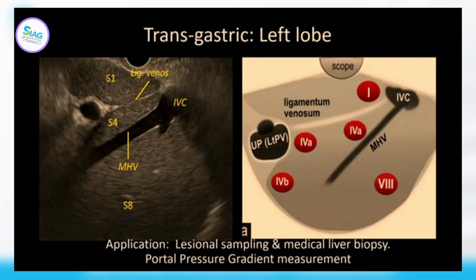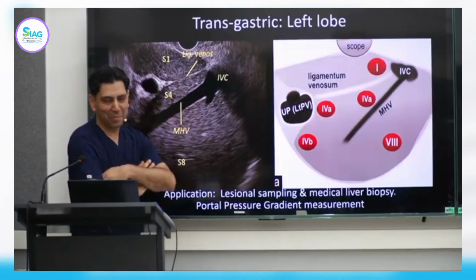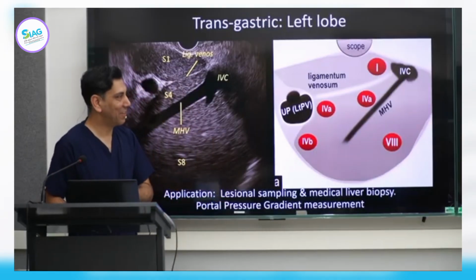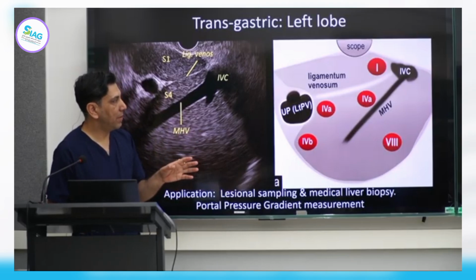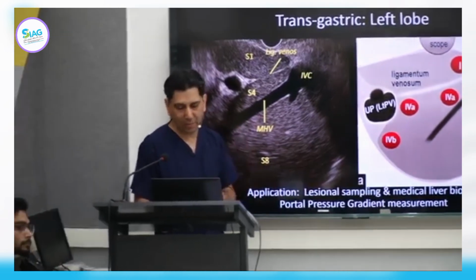Second, this is the mid-hepatic vein, but in 60, 70, even a higher percentage, the left hepatic vein and the mid-hepatic vein may have a common origin. So that happens too. Yeah, I think it's an incredibly important point, and I remember Ken Chang mentioning it. So looking at the wall can help in differentiating portal and hepatic vein.